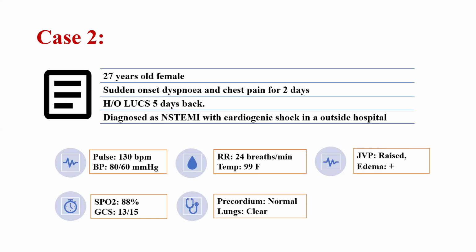But in that particular case, every case was nicely presented and nicely depicted the history and clinical intervention, as well as investigation done properly. What I just remember, you were talking about the second case, most likely pulmonary thromboembolism.